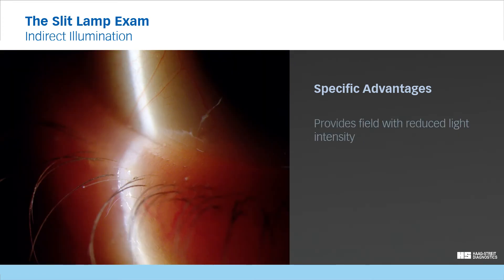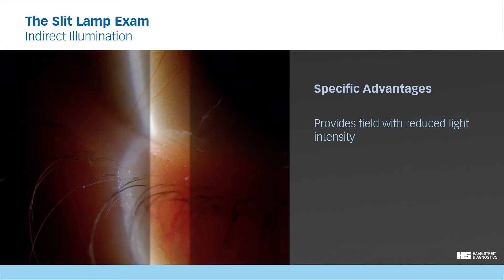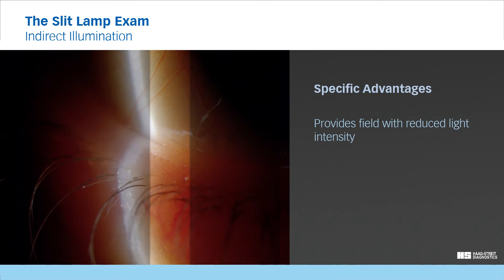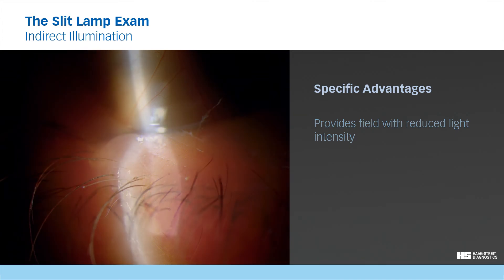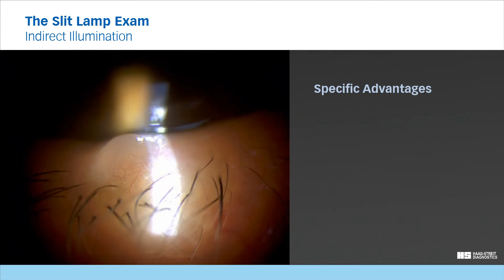Another advantage is that it provides a field with reduced light intensity for the structures adjacent to the directly illuminated field. For example, in this lid margin, the cystic structure is better visible in the indirectly illuminated field than in the direct illumination, where the detail is washed out.